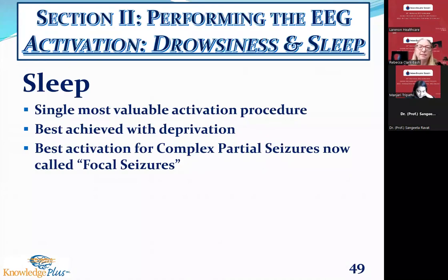Now the best sleep deprivation is 3 hours of sleep. And I like to tell patients to go to bed at 3 a.m., get up at 6 a.m. If they go to bed at 11 and think they're waking up at 2 a.m., it probably won't happen. It's easy to get into bed. It's hard to get out of bed. So I just say, try to get 3 hours, and absolutely the best thing your patient can do for themselves so that they can sleep during the test.